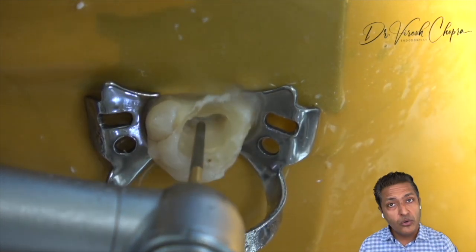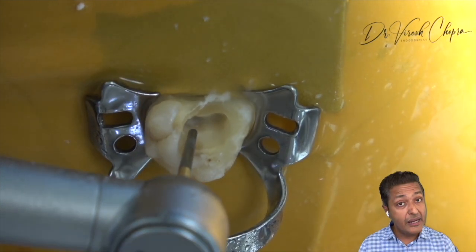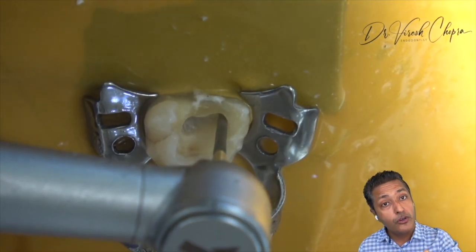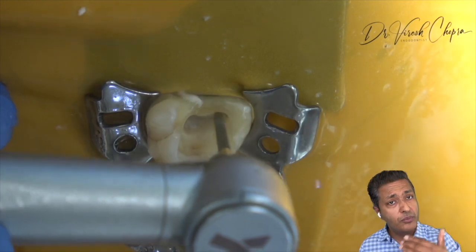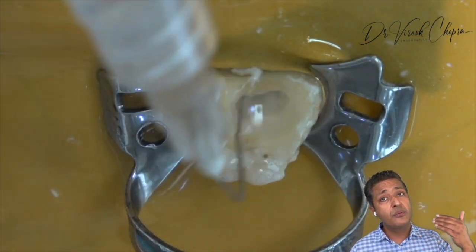How do we know that this is the periphery of the access cavity? That can be known when the enamel, dentine and the junction of the pulpal floor to the axial wall come in one line. We have to move our DG16 Explorer in that particular area and see that the axial wall is smooth.